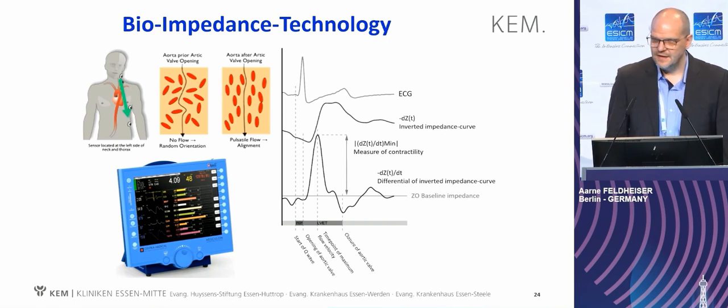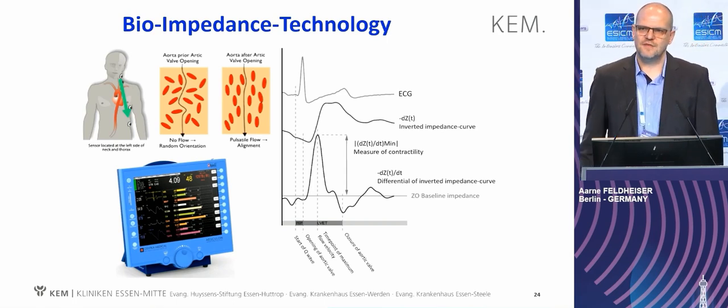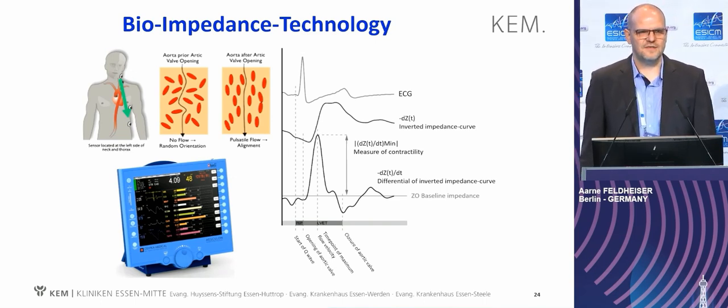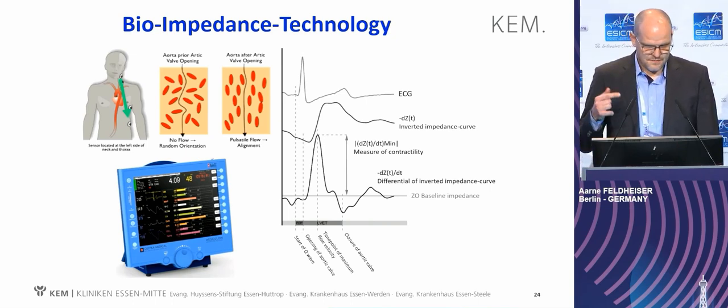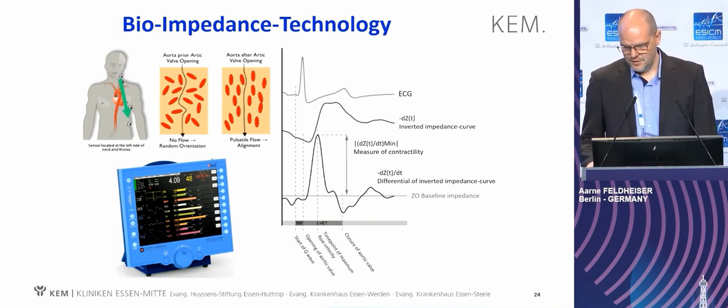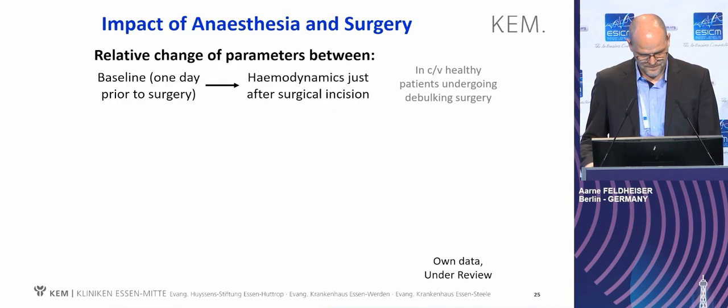And it is dependent on the flow, and during flow states, the erythrocytes align according to the flow, and in non-flowing states, it gets diffuse and chaotic. And deriving parameters from these flow measurements brings up the stroke volume and different hemodynamic parameters associated to cardiac function and to volume status.